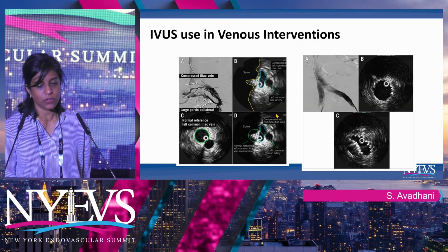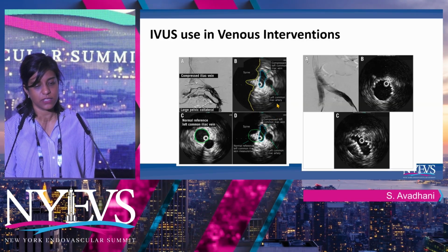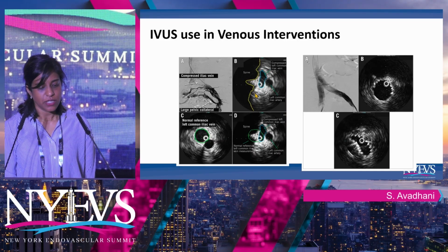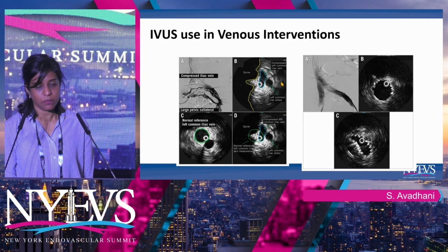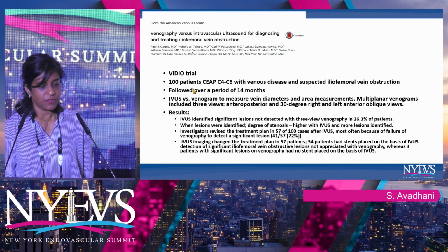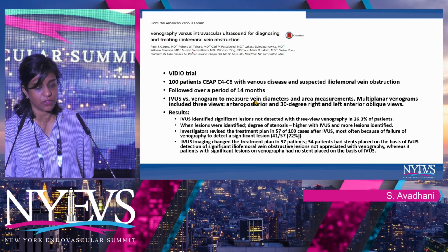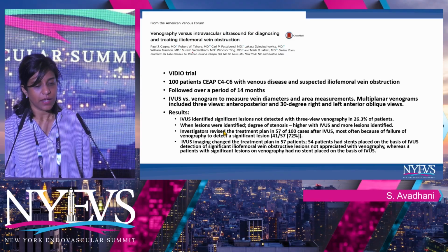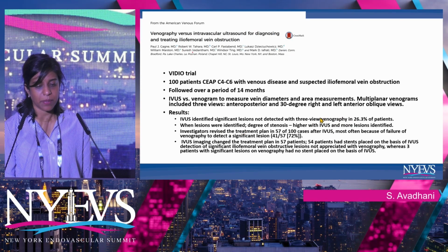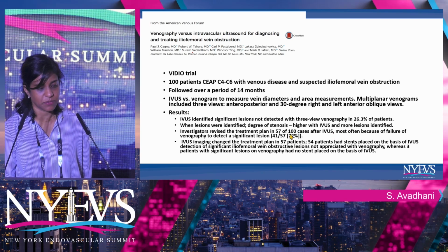And this is also a growing niche in venous interventions and deep venous obstruction, where IVUS does help identify these lesions a lot better. A lot of this data comes from the VIDIO trial, which was 100 patients followed over 14 months, where IVUS detected lesions that weren't apparent on venography in about 26%.